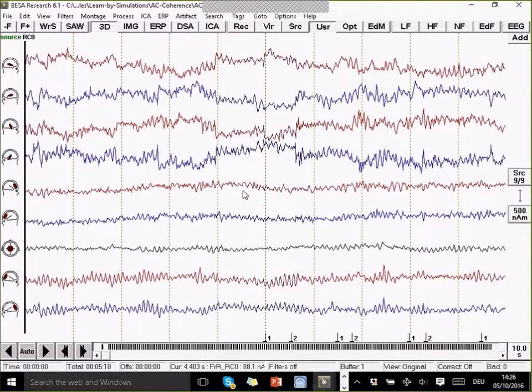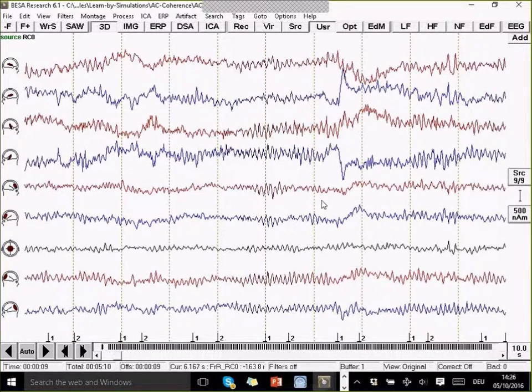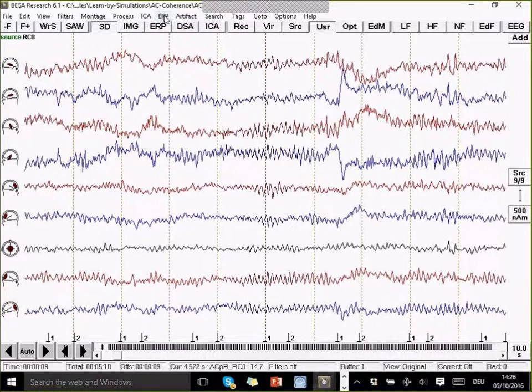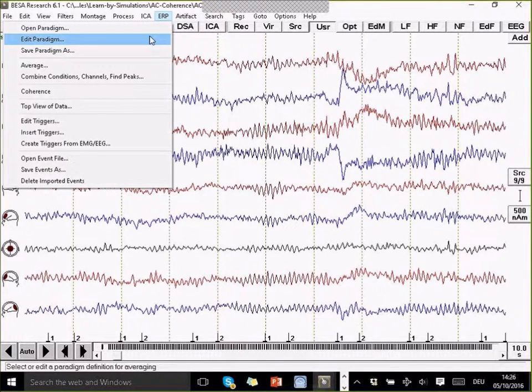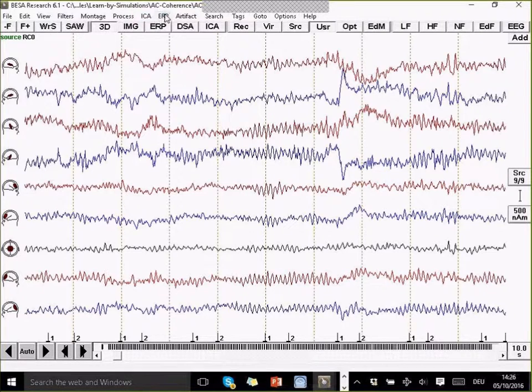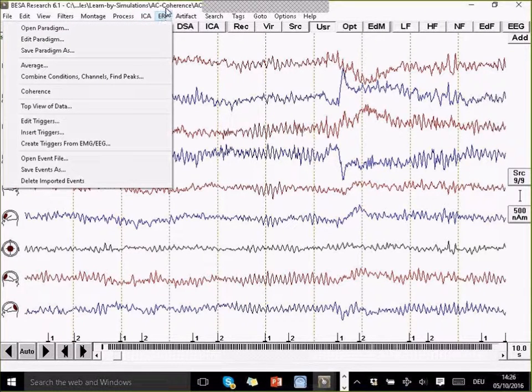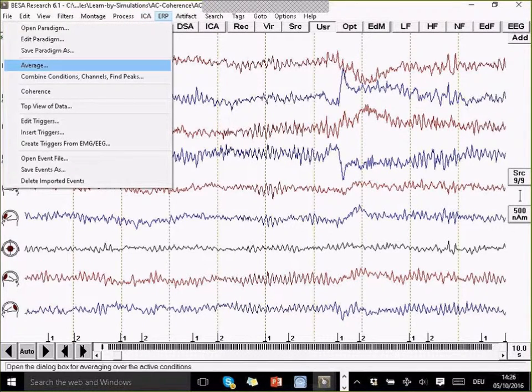I can see these little source symbols here. I can see my data have been transformed. Now I'm going to do a time-frequency analysis on this. This is done using the ERP menu in BESA research.